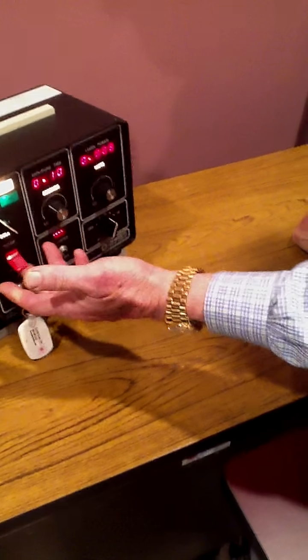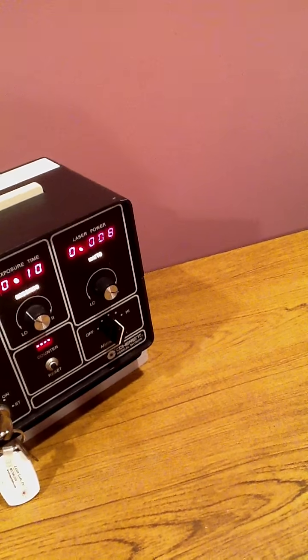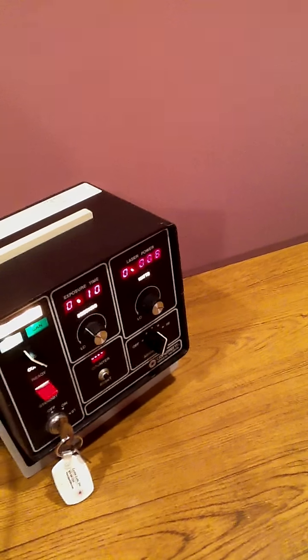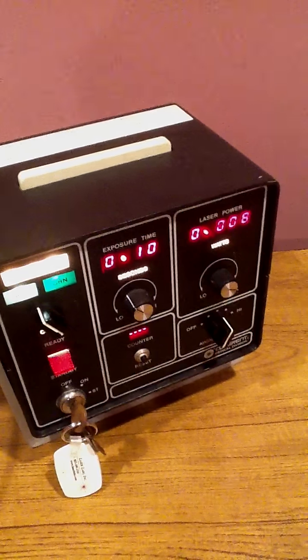The second step is turn on the water — it's a water-cooled laser. Third step is to turn the on-off switch and flip up the ready. Now you're going to see the laser power will gradually warm up to tell us how much power is on here. Take a little while.